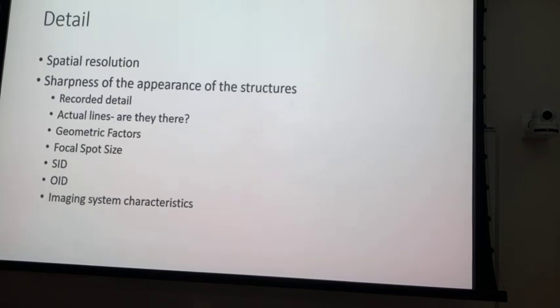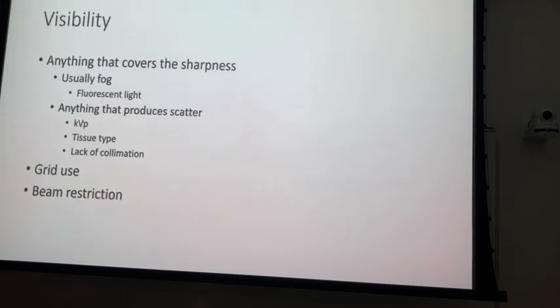So the general rule of thumb is that if you make an exposure and you adjust that image so that you can see it a little bit better on your monitor, you might process out some important information before you send it to the radiologist so that he can make a diagnosis, okay? You're using a low resolution monitor. His monitor is much higher resolution. So what you do to the image on your screen to make it look good may destroy the image on his screen. So, don't ever do that. You can adjust the image, but make sure that you save the original so that you can send it.